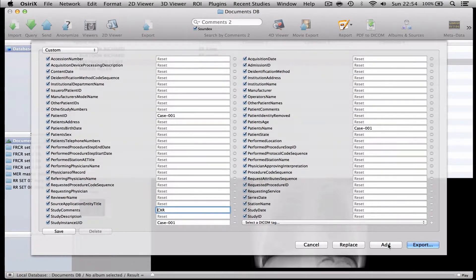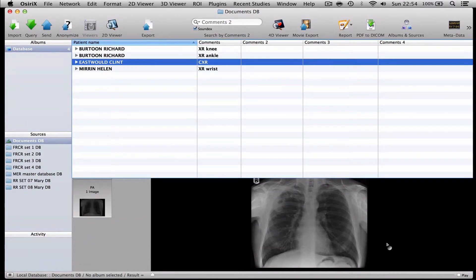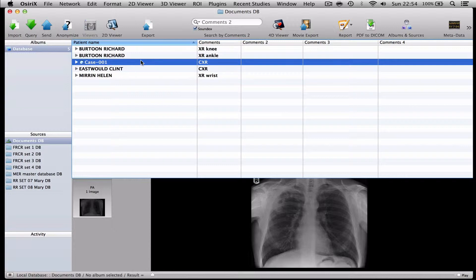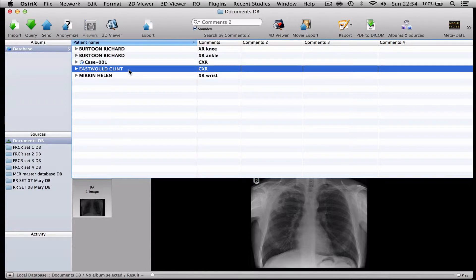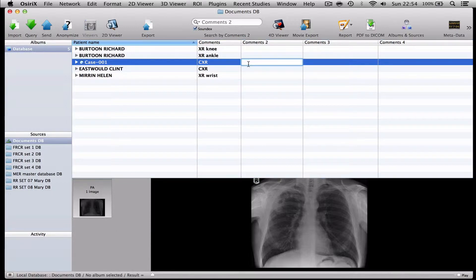So if I press add what will happen is that you will see in the database as well as the original unanonymised case I now have case 001 and I can fill in comments to the diagnosis here which is TB.